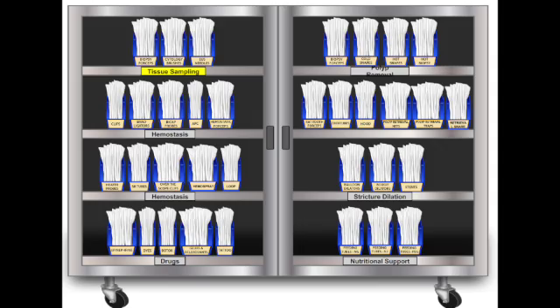A net on a catheter used to grasp and pull out large polyp specimens, or maybe multiple smaller polyps at once. Also essential for removing foreign bodies, like a large piece of impacted food. The classic steakhouse syndrome. Got it.